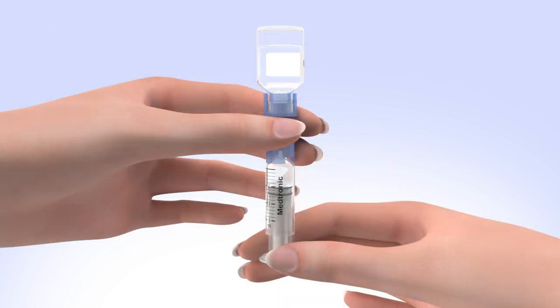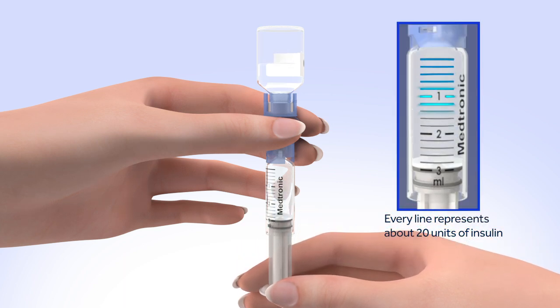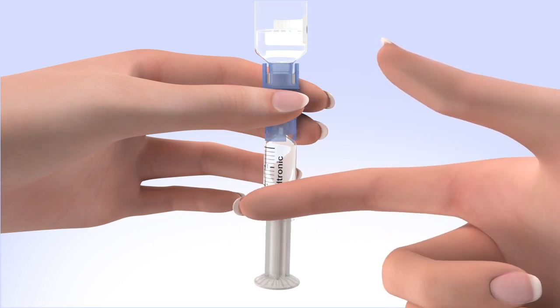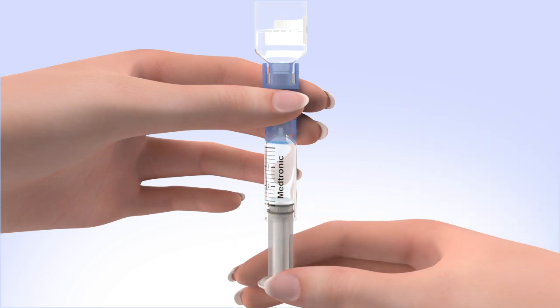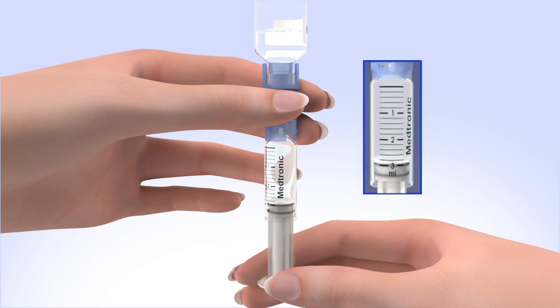When the reservoir stops filling, pull down on the plunger until the top black o-ring lines up with the desired amount. Tap the reservoir hard enough to make the air bubbles rise to the top. Slowly push up on the plunger rod to move the air bubbles back into the insulin vial. Pull down on the plunger to fill the reservoir to the number of units desired. Repeat as needed until air bubbles are removed from the reservoir.